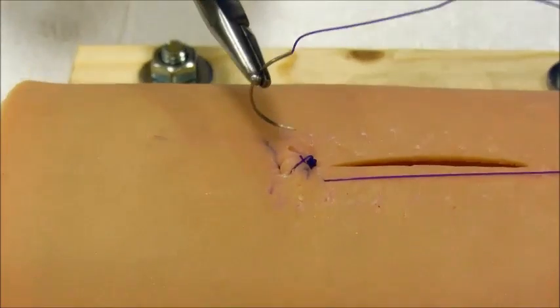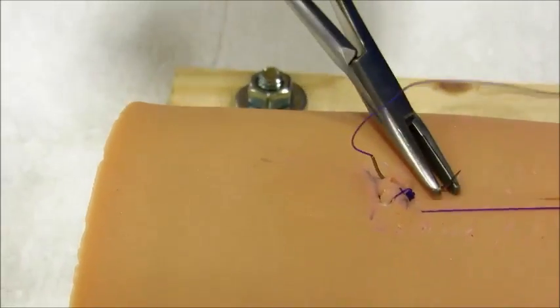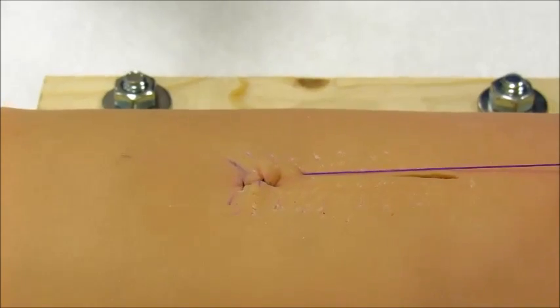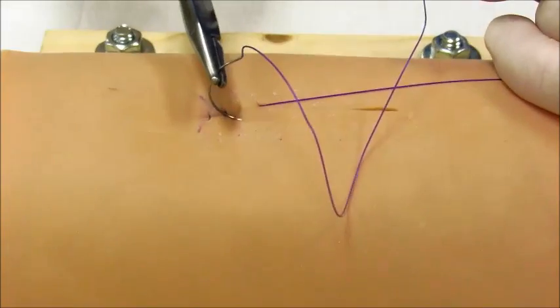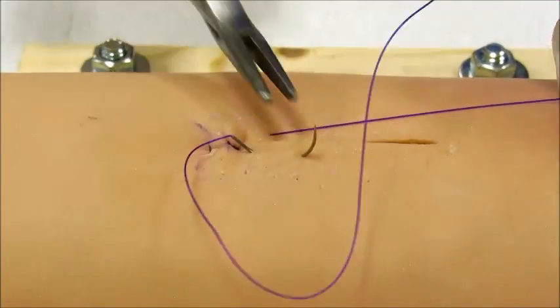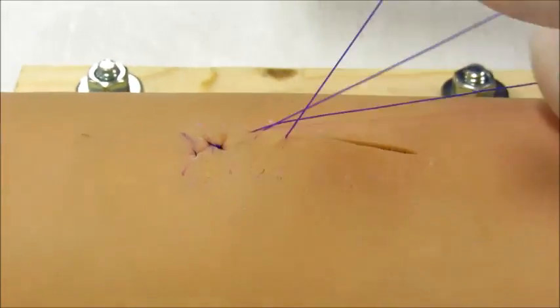So for this pattern, I'm just going to do bites that are parallel to the incision. Again, just going through the submucosa, not through the lumen. And you'll see here, as I pull, that buried the knot quite nicely. One important thing as you're closing these is that you're going to have to keep tension on the suture as you go in order to keep that tissue inverting. So I'm just going to take bites that are parallel to the incision, at least a couple millimeters away from the incision.